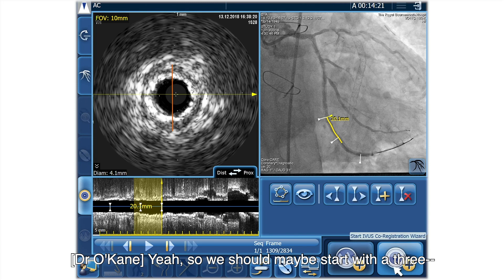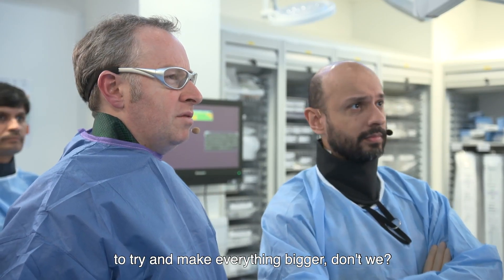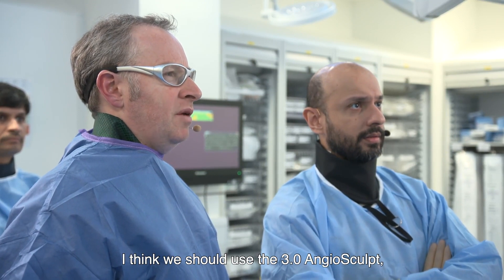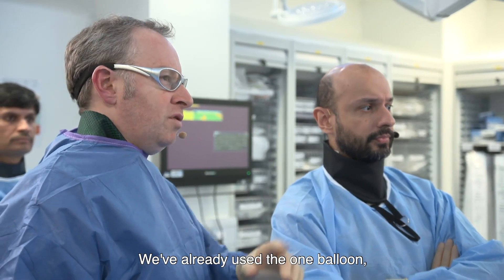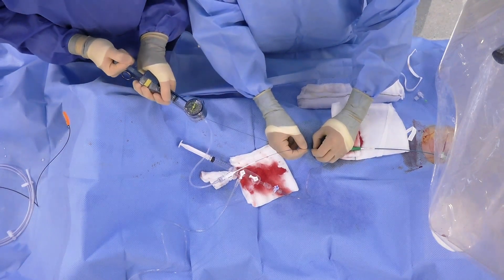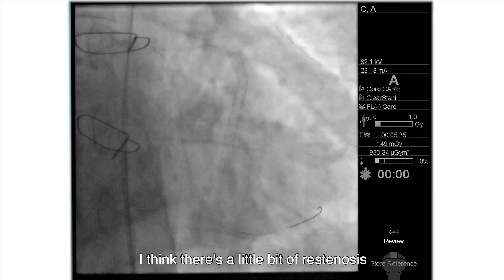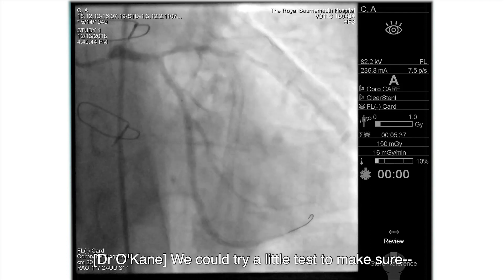So we should maybe start with a 3.0 - 3.0 angiosculpt? I think we need angiosculpt to try and make everything bigger, with a bit more power to try and expand those stents. I think we should use a 3.0 angiosculpt and then take a 3.0 NC. We've already used the one balloon, so we can get the angiosculpt down. There's a little bit of restenosis between those two little OMs - I'm just going to hit that, might as well.